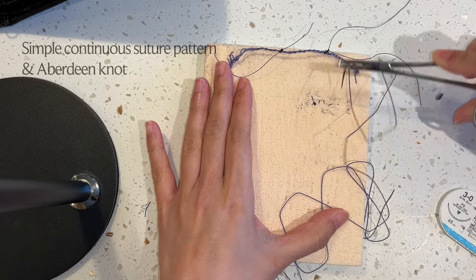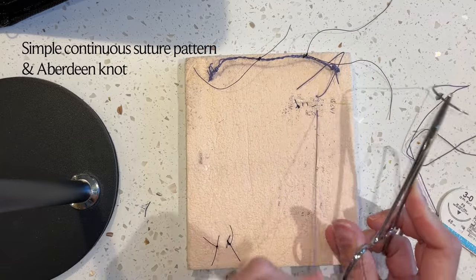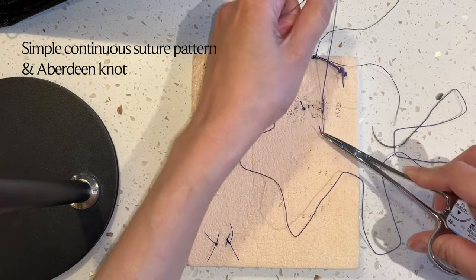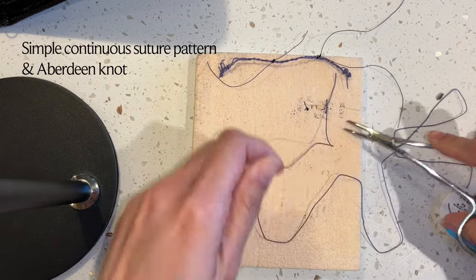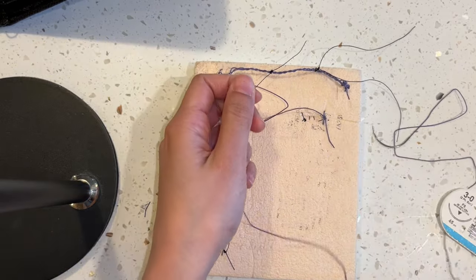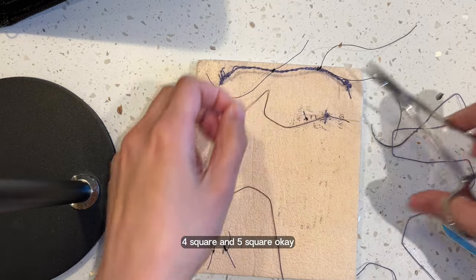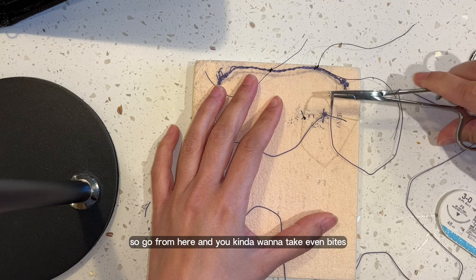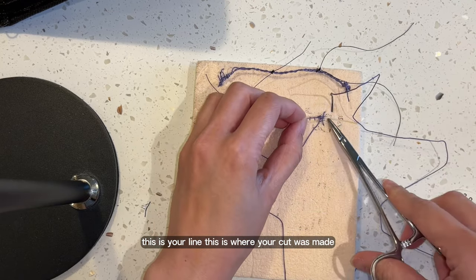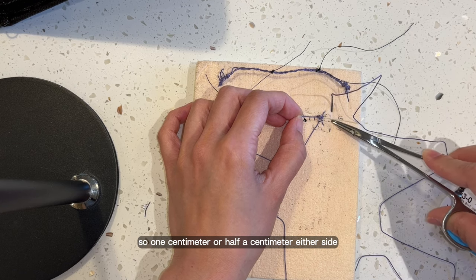So let's try again. Let's start — there's a very big needle for a small wound! So: one square, two square, three square, four square, and five square. And then use this one to go from here. You kind of want to take even bites, so what that means is if you look here, this is your line, this is where your cut was made — similar length, about half a centimeter or one centimeter either side.